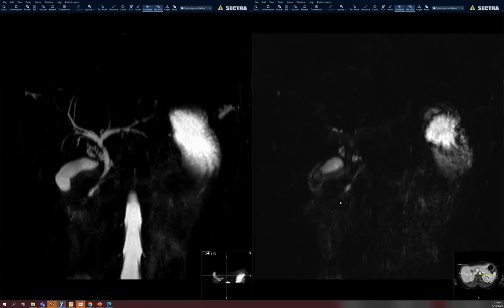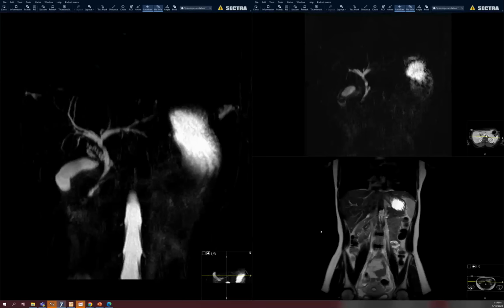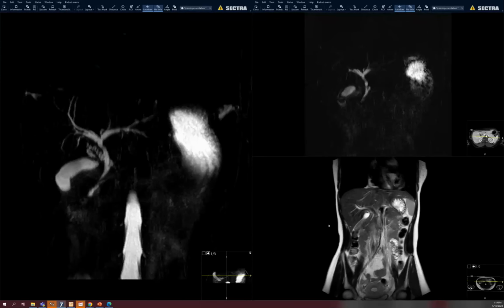So this patient had an ERCP done and they diagnosed that the patient has a common channel and the CBD is inserting into the pancreatic duct, and the CBD had some sludge there, so they removed that sludge and put a stent before this scan. During the scan they removed it, so that is the diagnosis. Just wanted to share one article related to that.